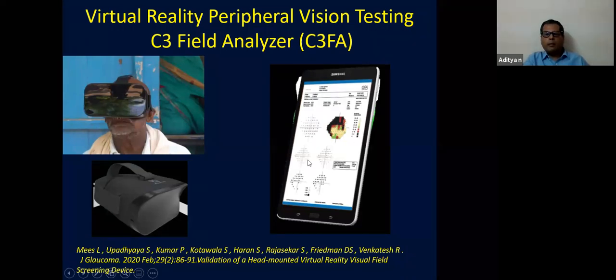And the reports can be seen in any instrument like this. It can be wirelessly transmitted. As of now, they have validated a screening protocol. Threshold protocols have not yet been done. So this is something interesting which might help us in the future.